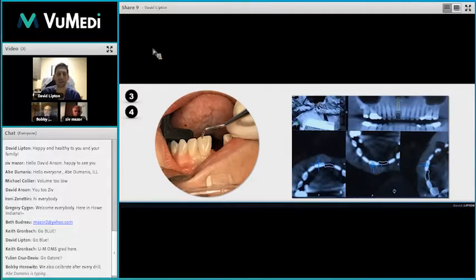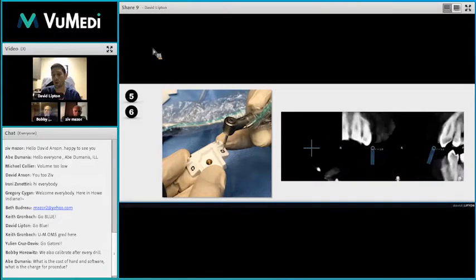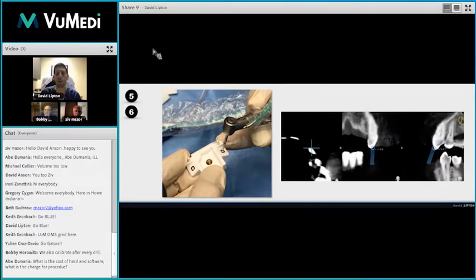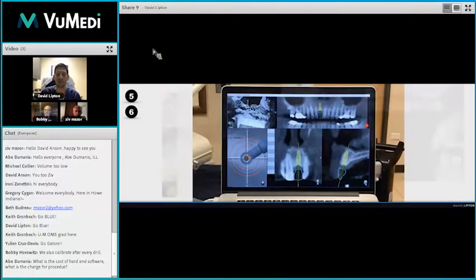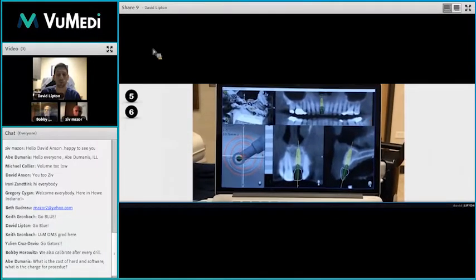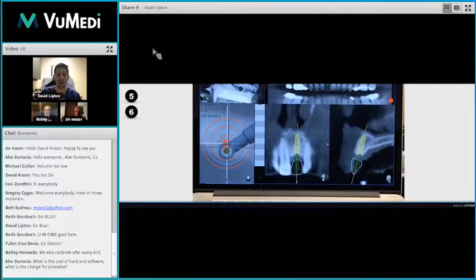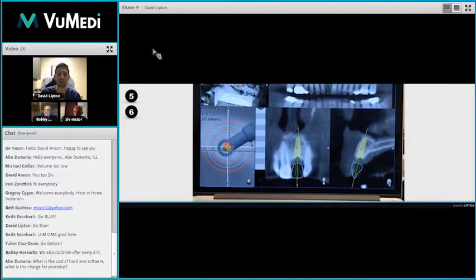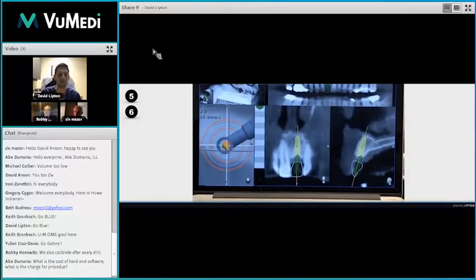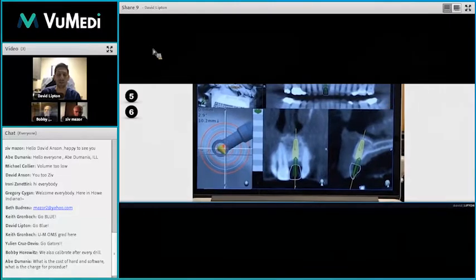Now we're going to calibrate our drill tip. We're going to drill our osteotomy. We're going to do another accuracy check to once again make sure nothing moved. And now we're ready to perform our osteotomy. And this is the screen that you're going to see as you're drilling. And this is real-time feedback of what you're drilling, exactly what's going on the computer screen. And there is a learning curve looking at a screen instead of looking at a patient. But once it clicks, it's very, very easy to make that transition, but there is a learning curve.